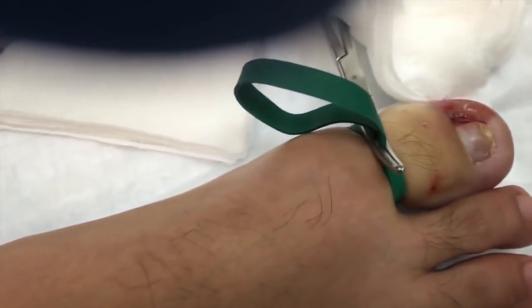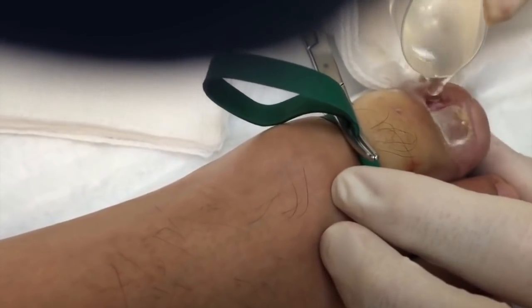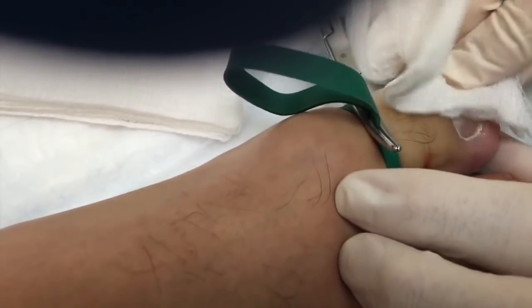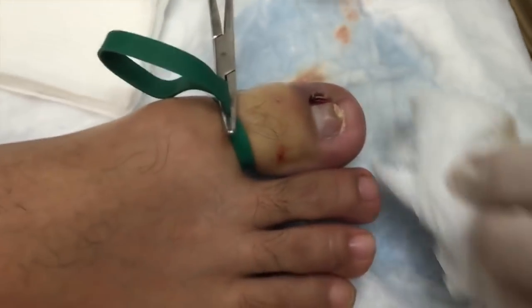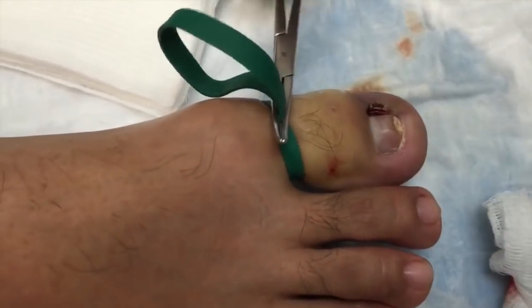Alright, so that's finished now. And we're just going to kind of flush that with a little hydrogen peroxide. There we go. And we are finished. Now, we've given our patient some pain medication. We've given them some anti-nausea medicine and some antibiotics. And he'll do just fine.